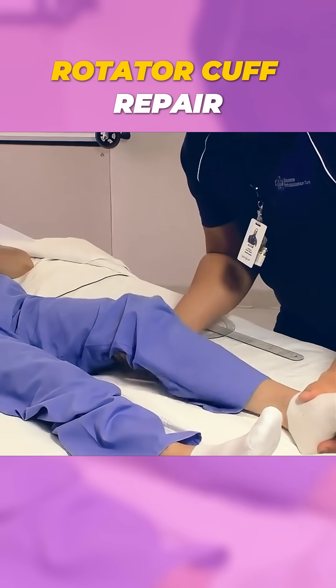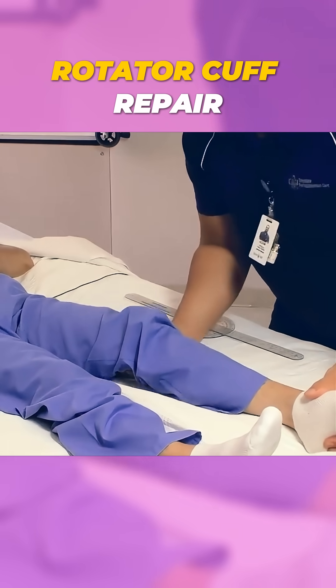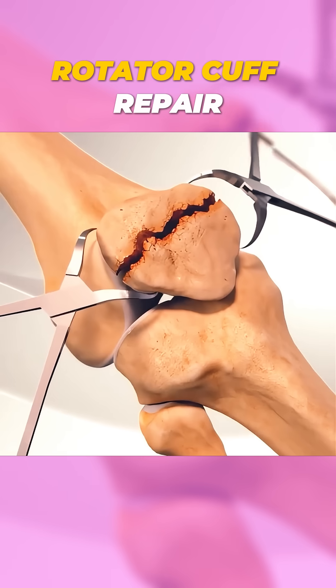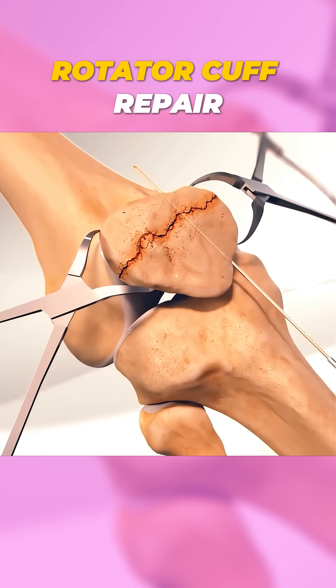After closing the incision, the patient undergoes rehabilitation to regain strength and flexibility. Modern surgical techniques and precise care ensure most patients can return to their daily activities within a few months. Isn't it amazing how medical science helps restore something as vital as your knee's movement?